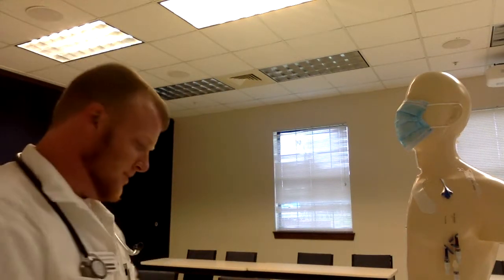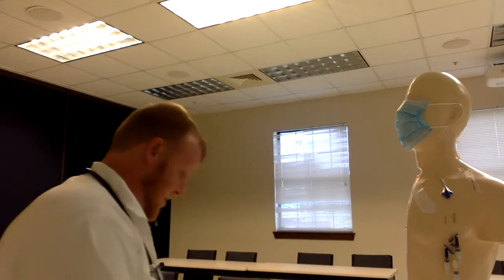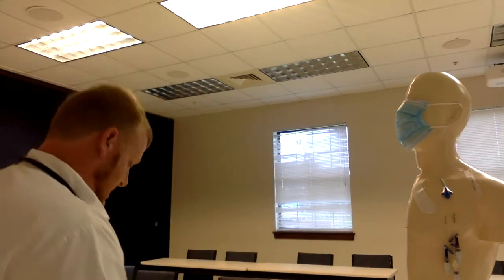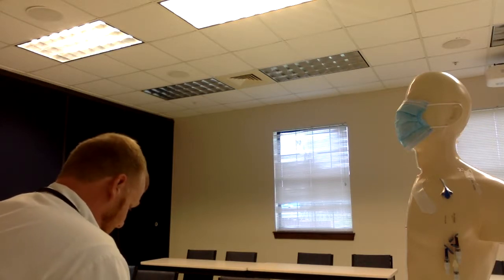Take my clean gloves off. Now I'm going to don sterile gloves. I touch the outside, open them up, making sure that I don't contaminate the gloves.